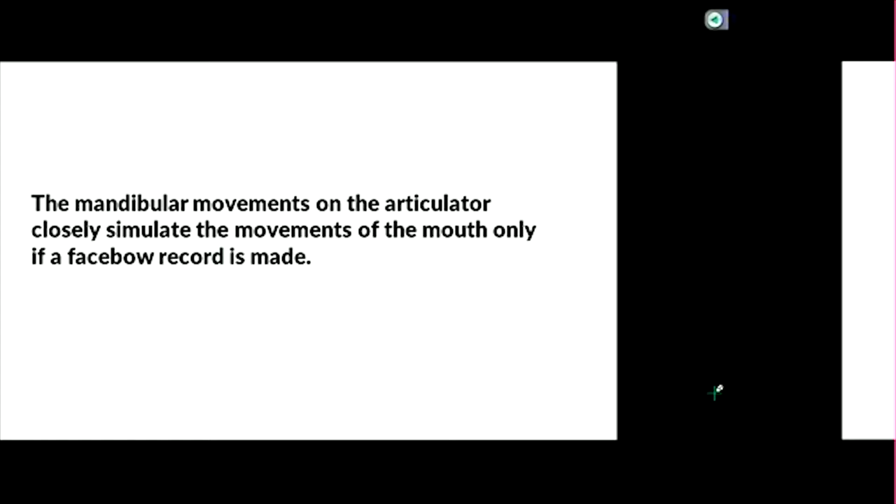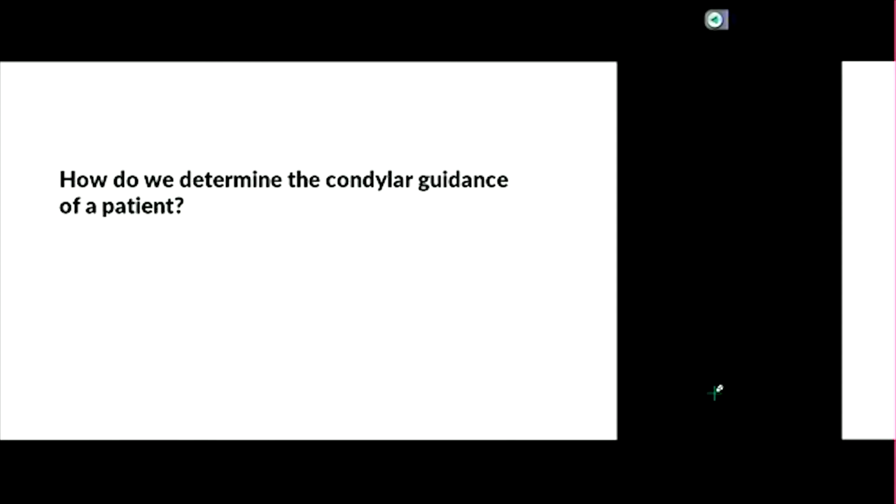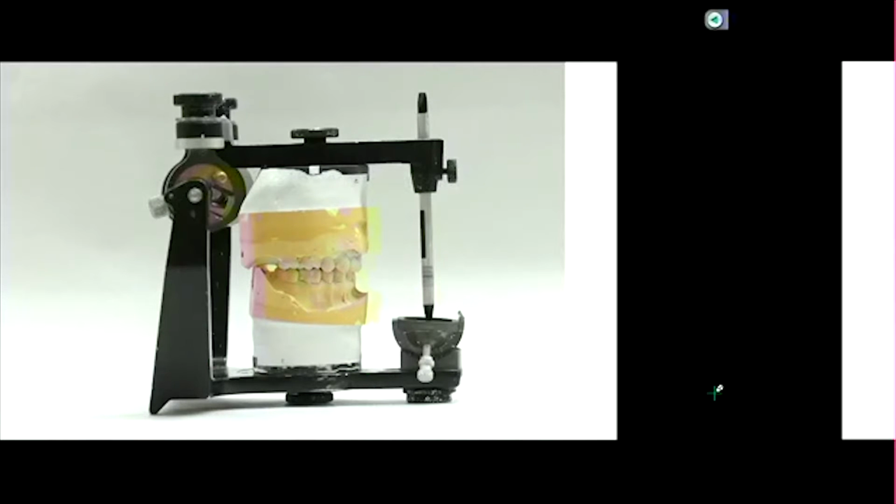How would we know the individual patient's condylar inclination? Great question. We'll get to that now. How do we determine the condylar guidance of a patient? That's the question of the day.